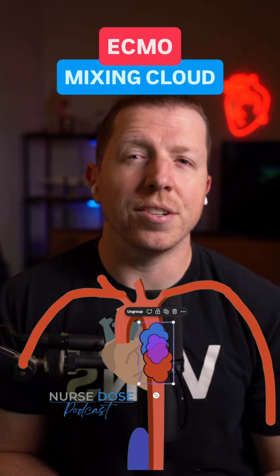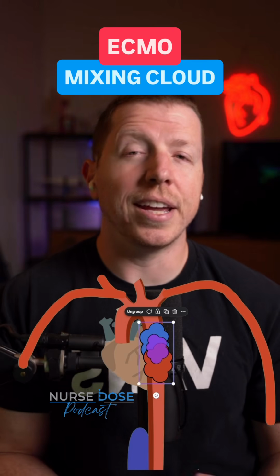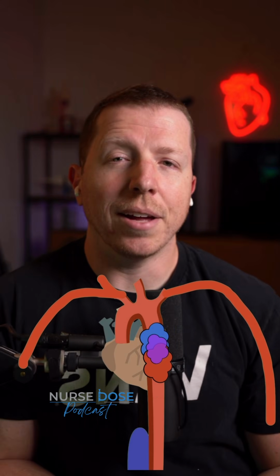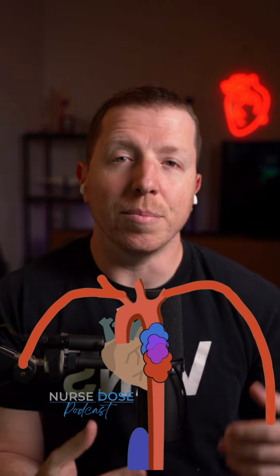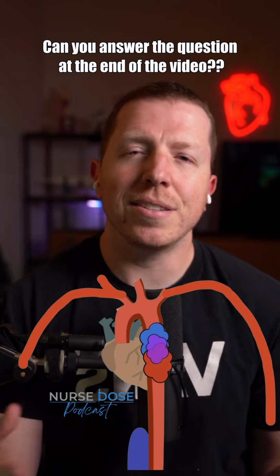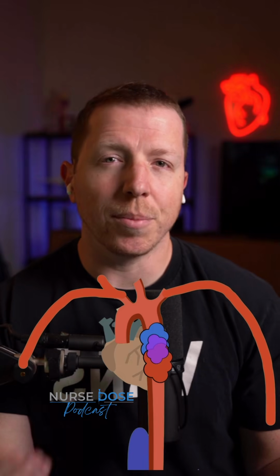So if you take care of patients on VA ECMO, especially if they are cannulated peripherally, this is a concept that you really need to know. Today, we're going to be talking about the mixing cloud, and this is the point where the oxygenated blood that is coming from the ECMO circuit is mixing with the poorly oxygenated blood that is coming from the heart, since the lungs aren't doing very well.